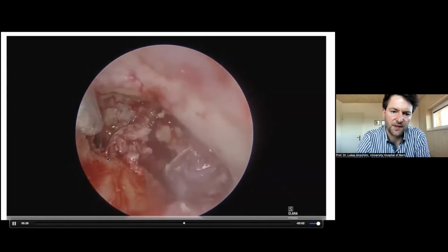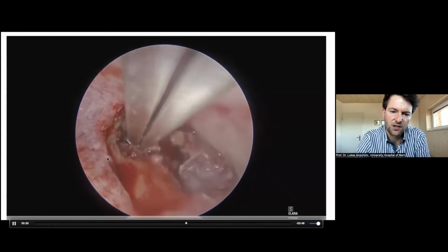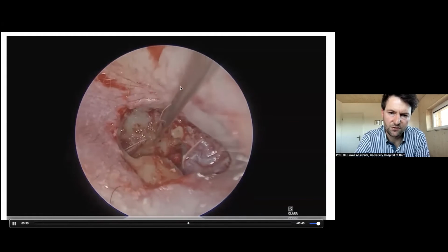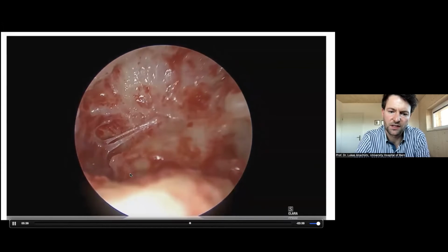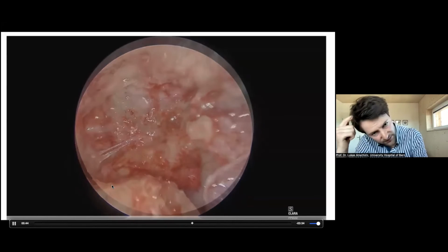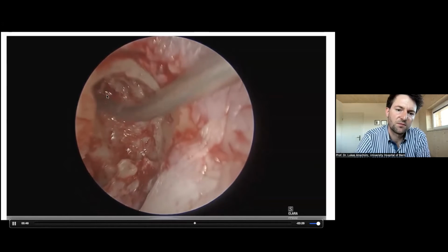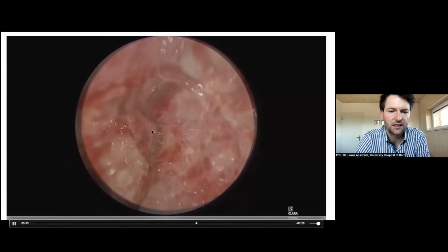Now you can see this is even a little bit bigger Thomasin dissector, so I can go more posteriorly. You can see this is the situation at the end. This is a 0-degree endoscope. Here is the dura, facial nerve. Here is the lateral semicircular canal. And now with the 45-degree, I can go inside this cavity, and I have here a custom-made suction. It's just a regular suction that I bend during the surgery.